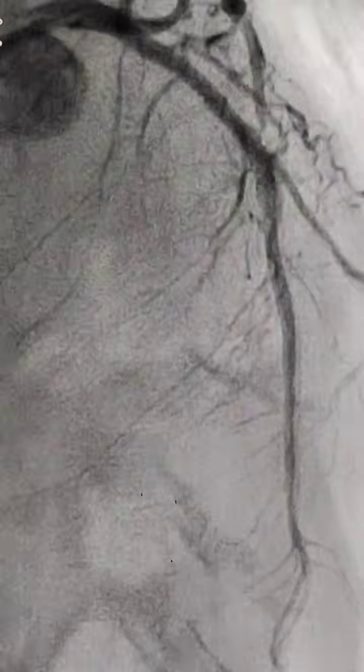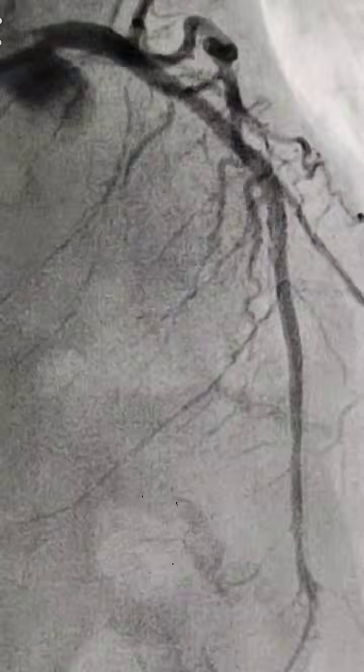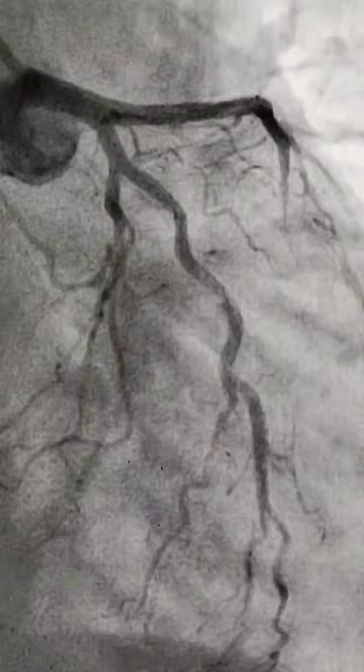See how long the LAD is. It almost wraps around the apex. That is why in leads 2, 3, aVF also I was getting ST elevation in this patient. This was the RAO caudal view. This was the cranio-caudal view.